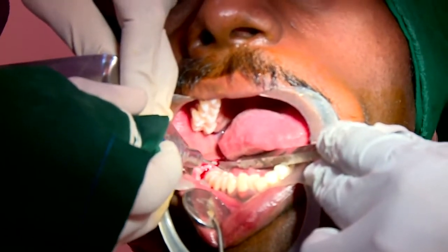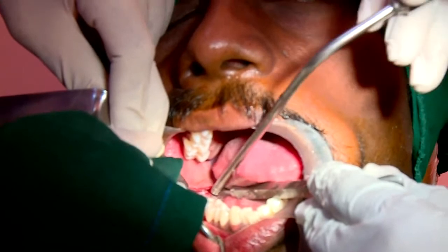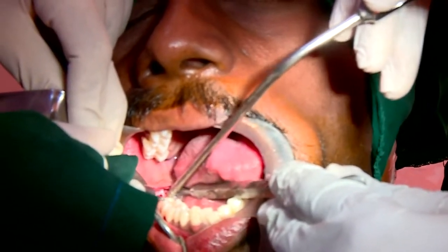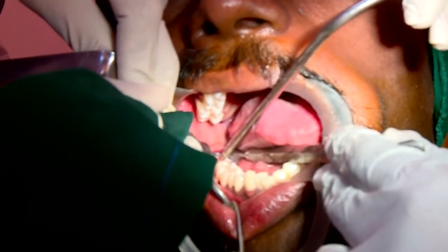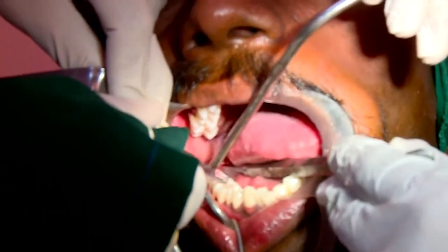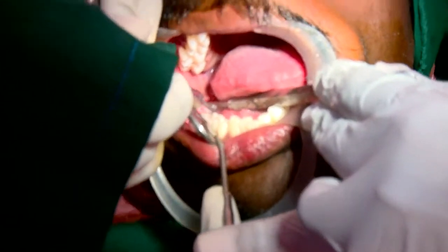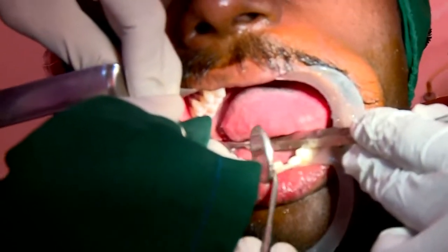So what I'm going to do is make an oblique cut on the crown, exactly on the cervical line, slightly posterior to the root aspect and slightly anterior to the inferior aspect, but not on the lingual side. I'm going to gutter the entire thing on the buccal side to avoid injury to the lingual nerve.